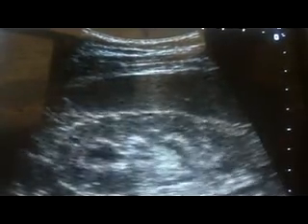Now we move to the left side. Let's do that. Because this is usually a bilateral condition, so let's see the status of the left kidney as well.